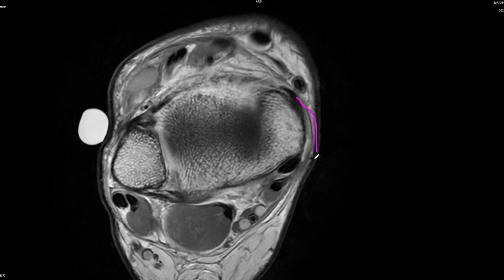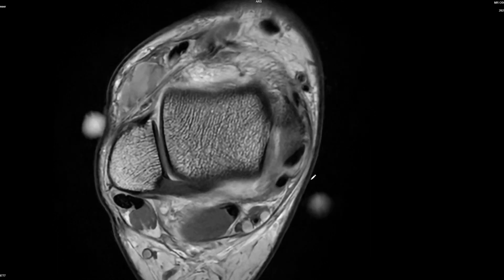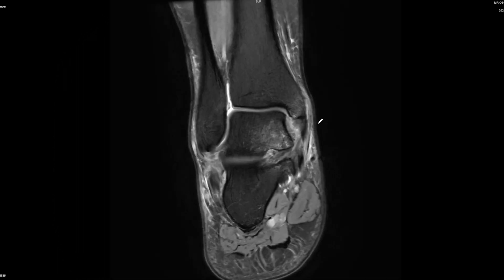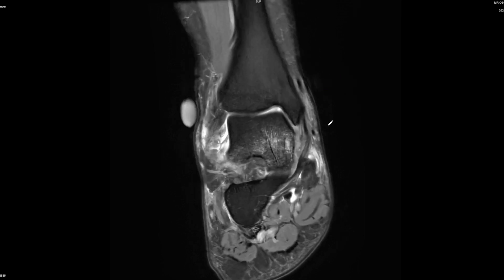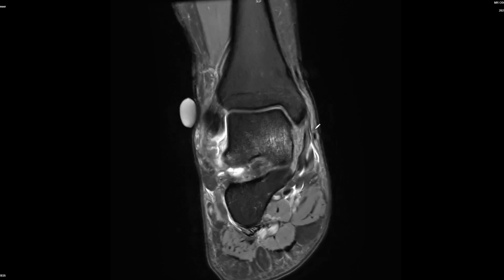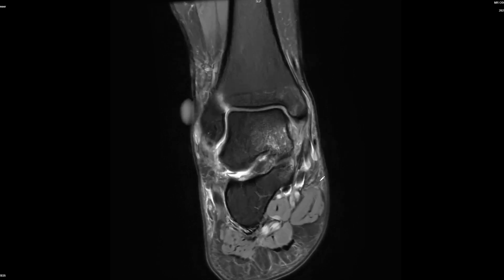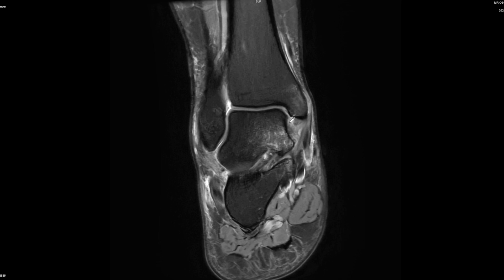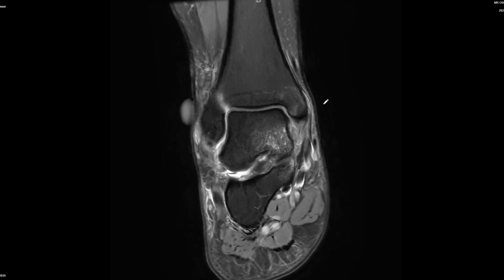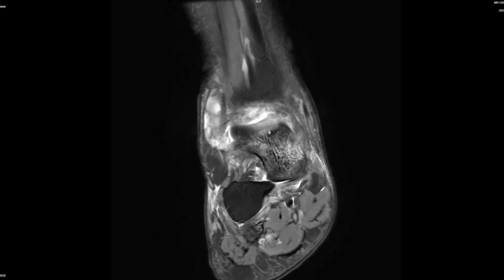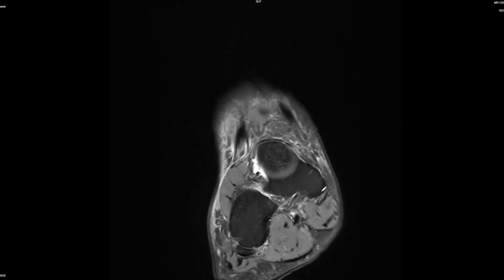Only one or two people actually described this specific finding of flexor retinaculum periosteal stripping. I wanted some description of the superficial deltoid region as a qualifying criteria and not just a normal superficial ligament, so I was quite generous in what was accepted here.